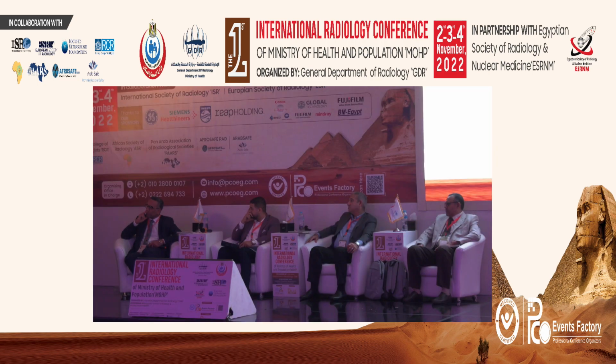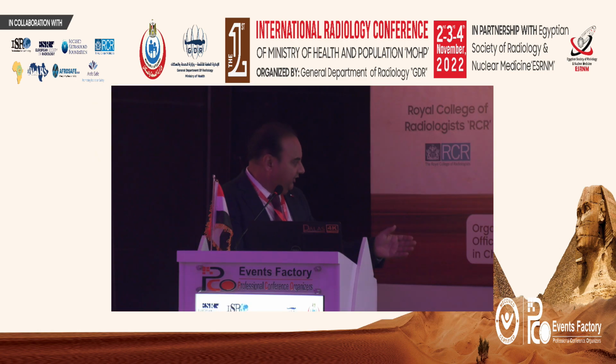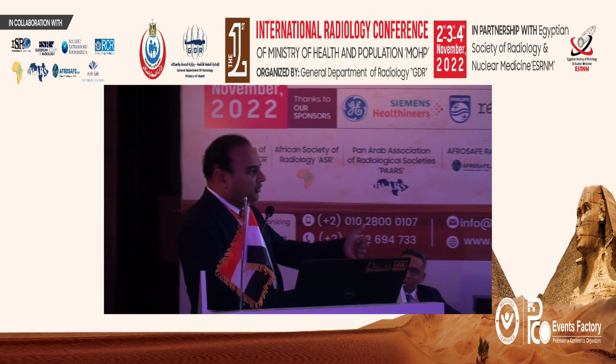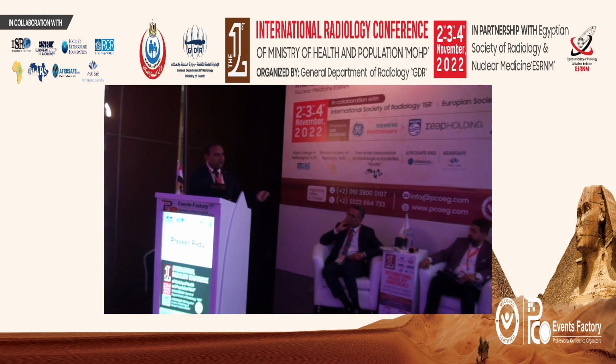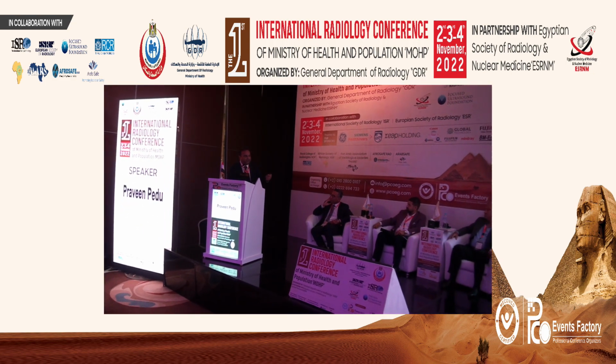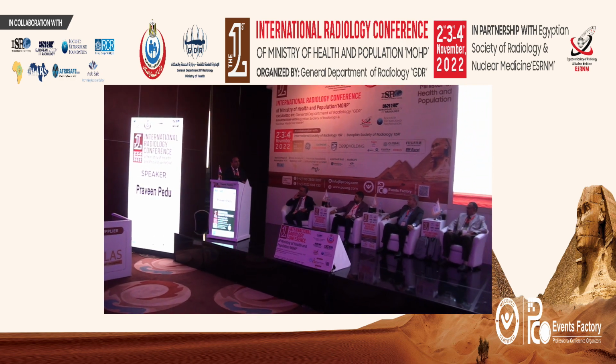Thank you. I think IRE is not going to replace surgery. It's not a substitute for surgery. I think for lesions which are, say, 3 centimeters and above, if the patient can have surgery, then surgery is definitely the first line of treatment. And if the lesions are less than 3 centimeters, and if the patient has got comorbidities, and where you can avoid major surgery, if the patient is suitable for microwave ablation, I'm talking about liver lesions, suitable for a thermal ablation, that remains the first choice because it's simple, it's quick, easy to use, it can be done in 15-20 minutes. I'm sure all of you agree with that.